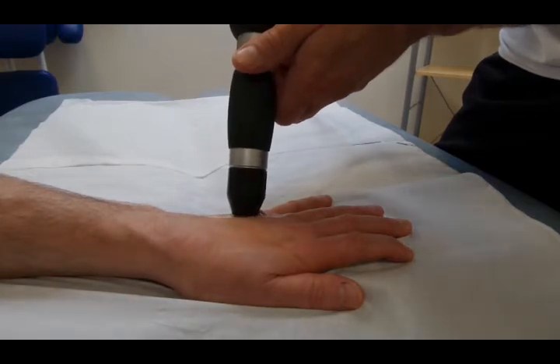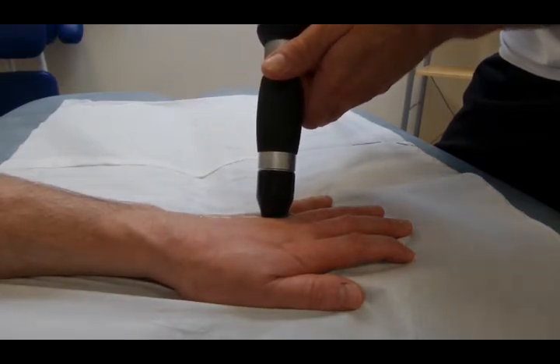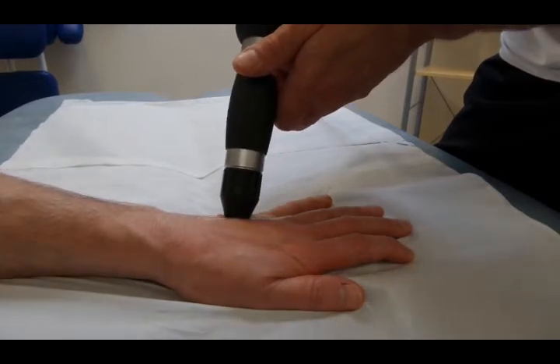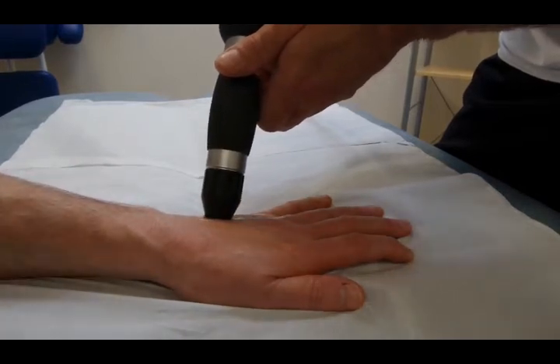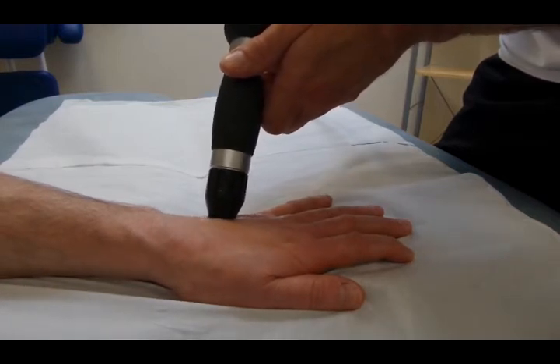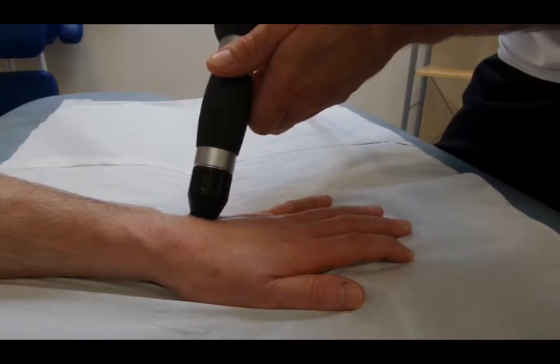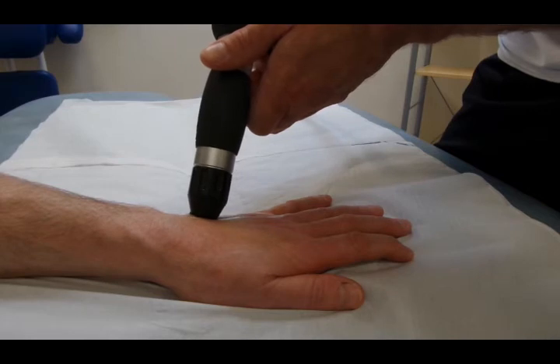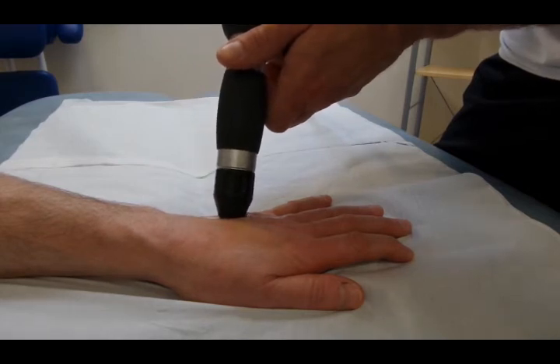I can actually see the groove in between the metacarpals now, which you didn't have originally. This area isn't as bad up here though — I mean last week you couldn't tolerate this at all. I was on this for a few seconds, and this week I'm on it a lot longer.